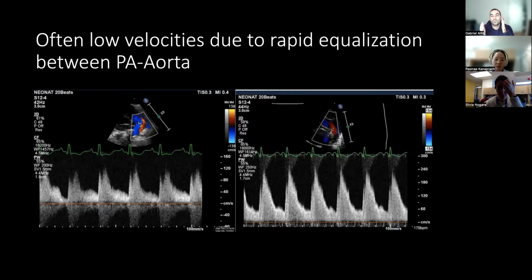Typically the restriction will occur as this structure becomes narrower because it becomes like a funnel. So think of you going into the garden and putting water on your plants with a hose. If the hose is becoming narrower and narrower, eventually the pressure will build up on the end that receives the water, and it will spurt into the environment. That's the idea of being restrictive.